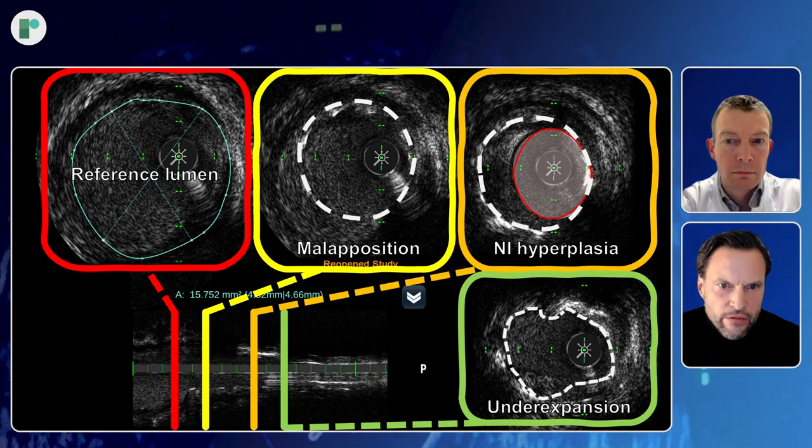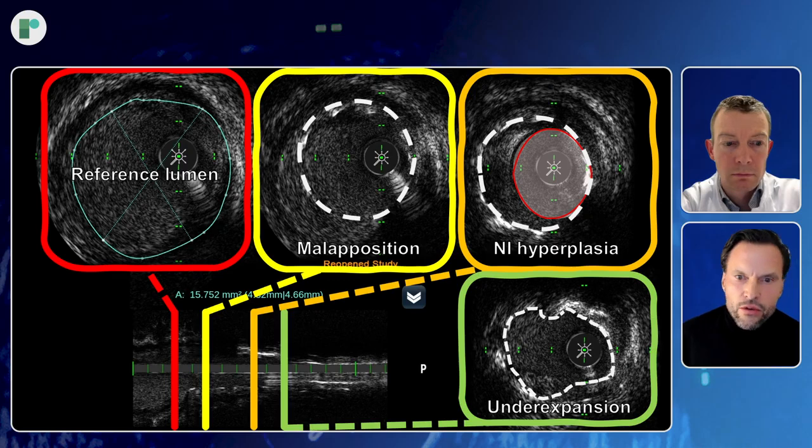And for me, every patient with de novo angina after pre-treatment and stent placement is automatically a complex situation, because you can't really estimate the total amount of disease just by doing an angiogram. And this is clearly an indication for IVUS, to understand what's going on and then to plan your treatment strategy in those patients.